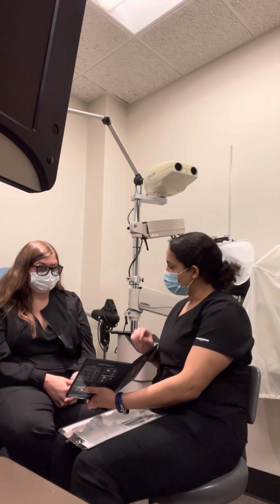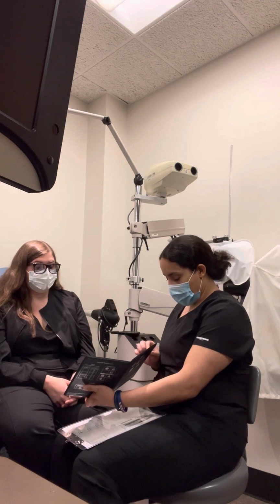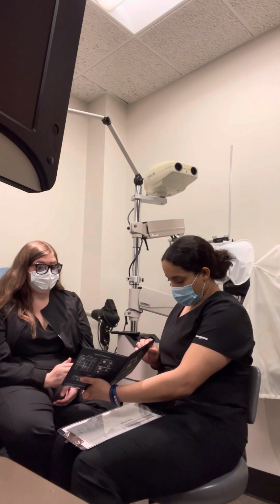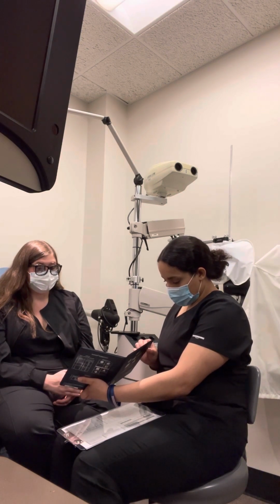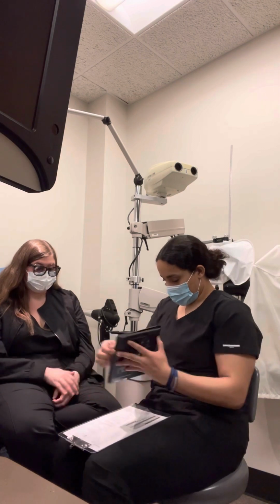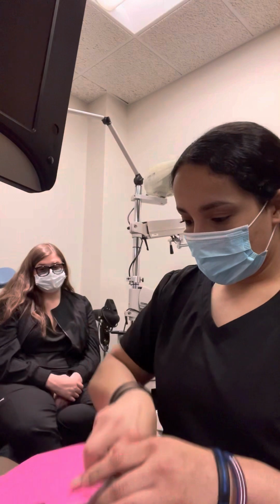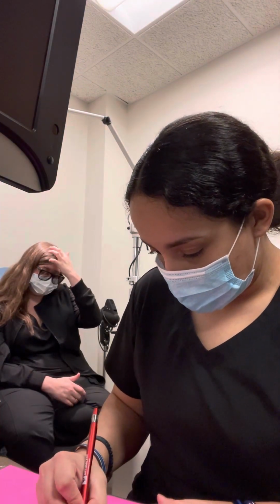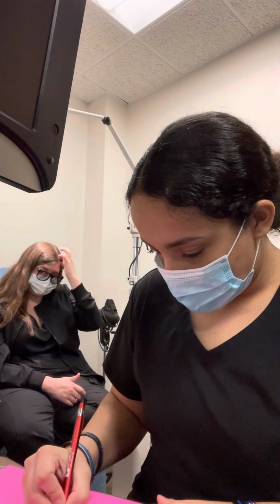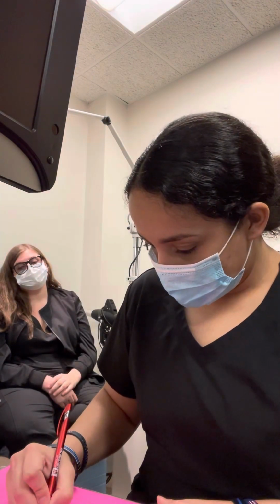Okay. And in these boxes, there's going to be a circle that pops out at you. Just let me know if it's left, middle, or the right one. Okay. Left, right, left, middle, left, right. Okay. Alrighty. Thank you, Miss Barber. Okay. So for her stereopsis, she is a positive RDS with 70 seconds of arc. Method Randot.